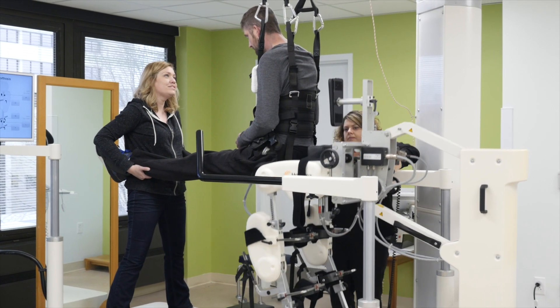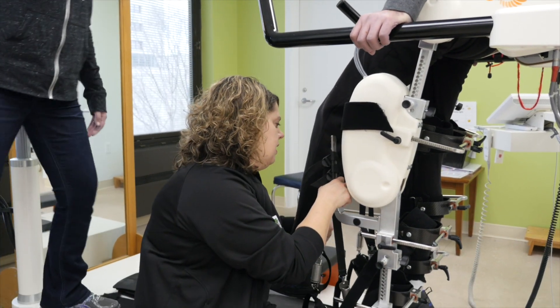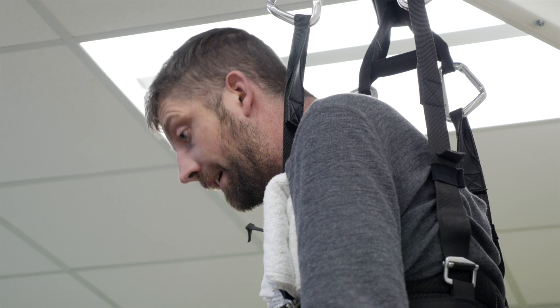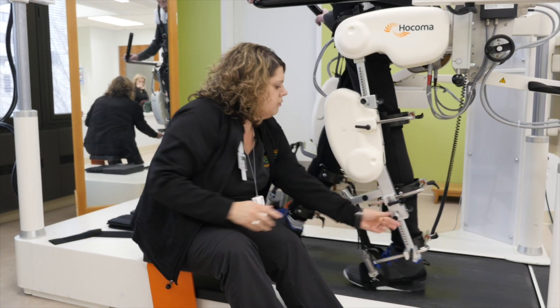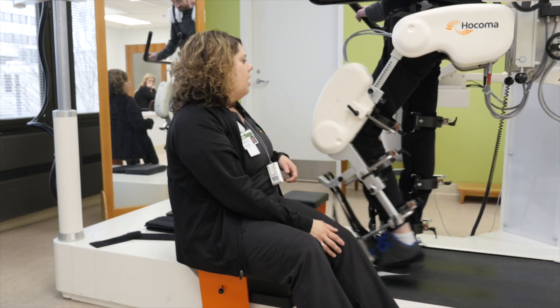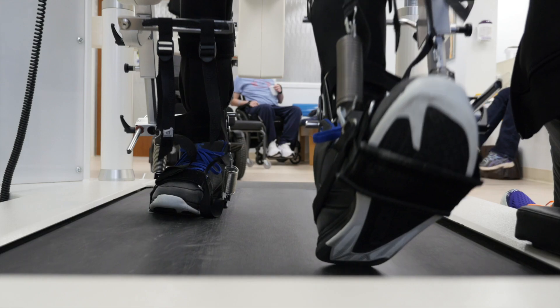The other really cool piece of technology we have in the gait room is the Locomat. The Locomat is robotic body weight supported treadmill training. There is a harness that suspends a person's body weight, and then there are robotic legs that are attached to the patient — it actually moves their legs at the hips, knees, and ankles to provide a normal gait pattern.